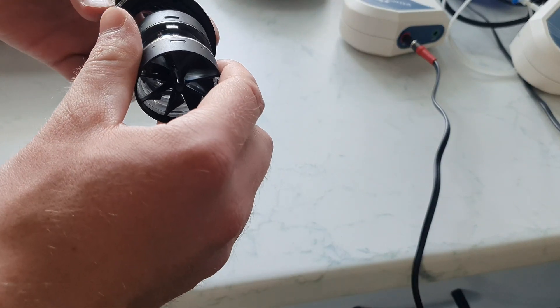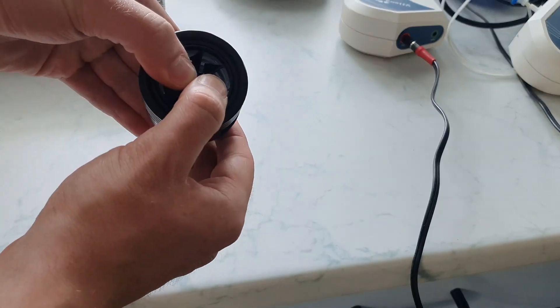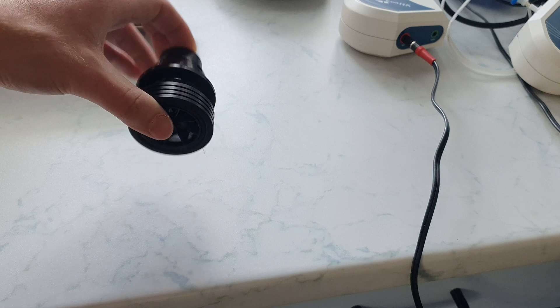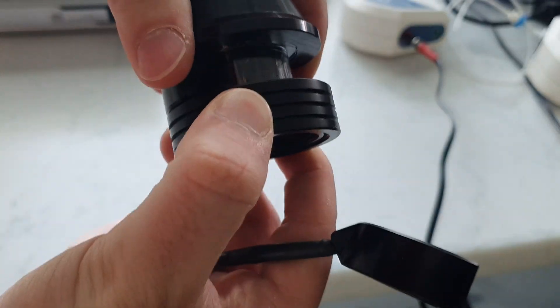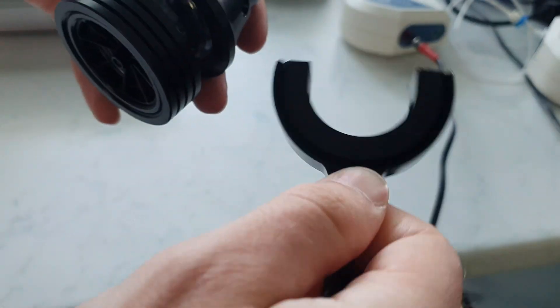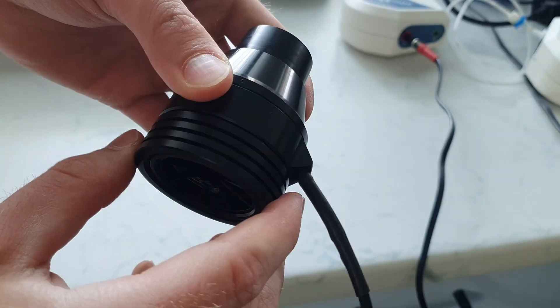Here the turbine is inserted into the turbine adapter. The turbine must be inserted with the grill first. It is important to insert the turbine firmly enough and completely. The turbine adapter has a mechanism with which the turbine can be fixed; the fixation should work without high force and is secured with a 180-degree rotation.